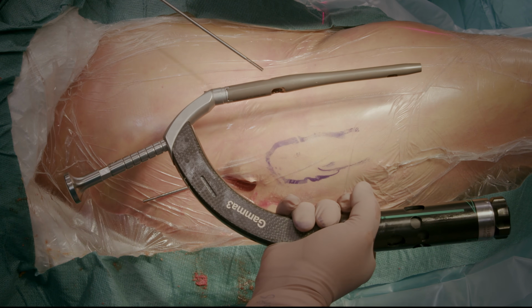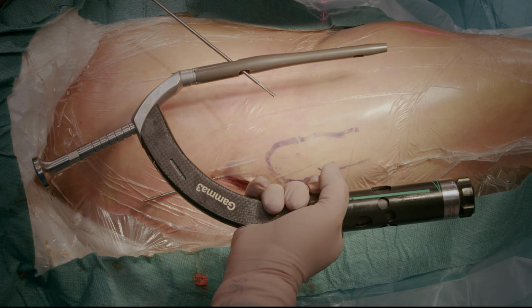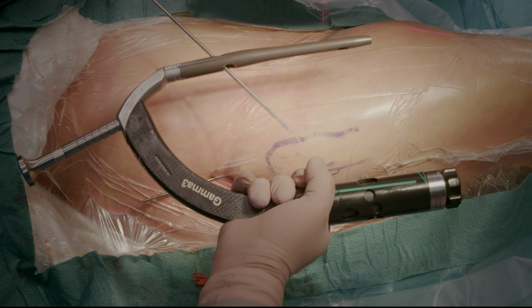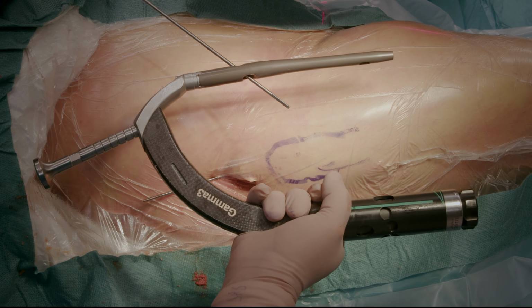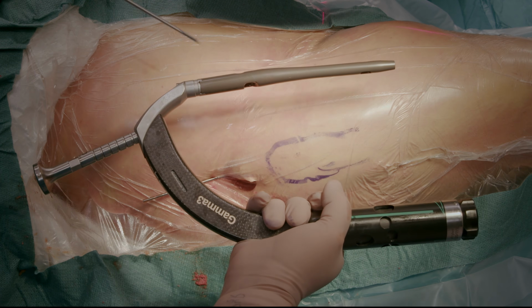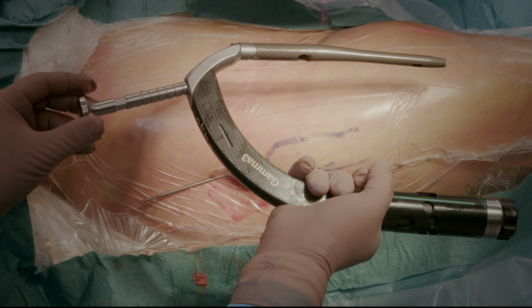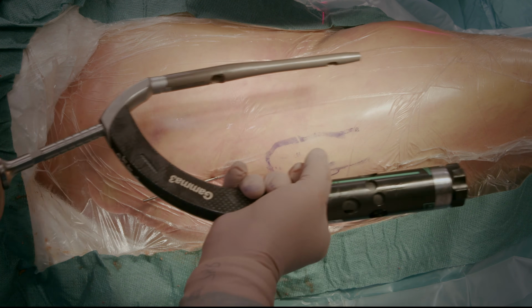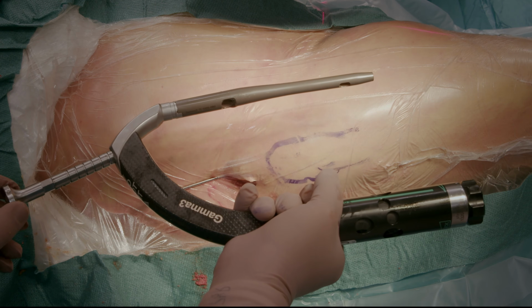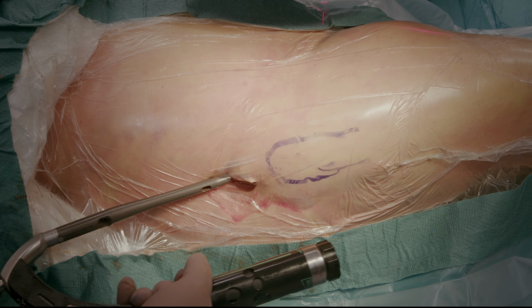The femoral neck angle should be ascertained preoperatively from the intact side, as these nails are available with several femoral neck angles. In this case, we have chosen a 125-degree nail. You can connect this strike plate to the target device in case you need to impact the nail deeper using a mallet. But we start introducing the nail by hand.